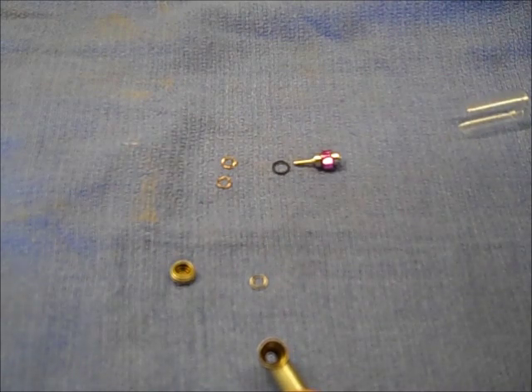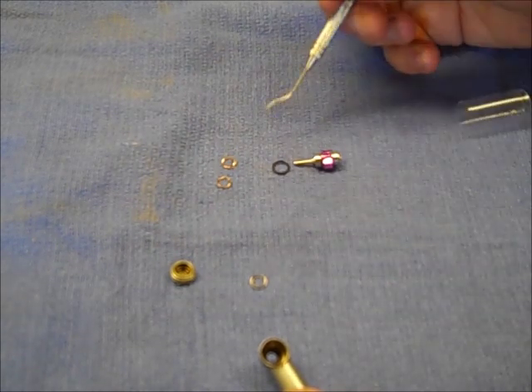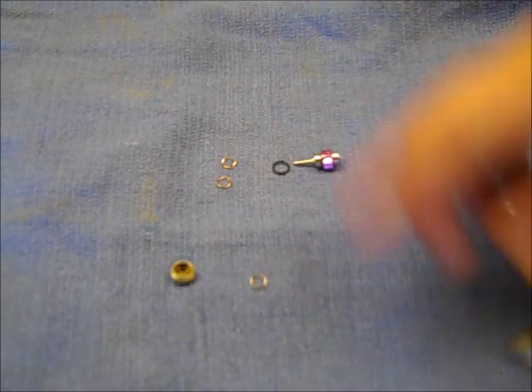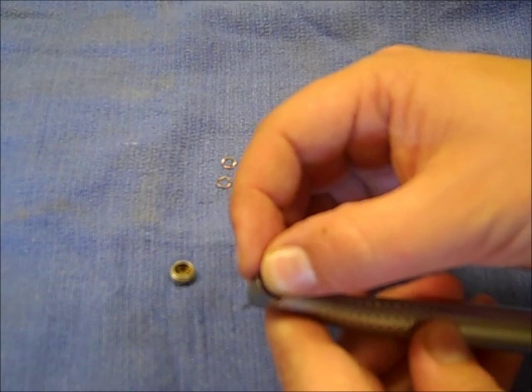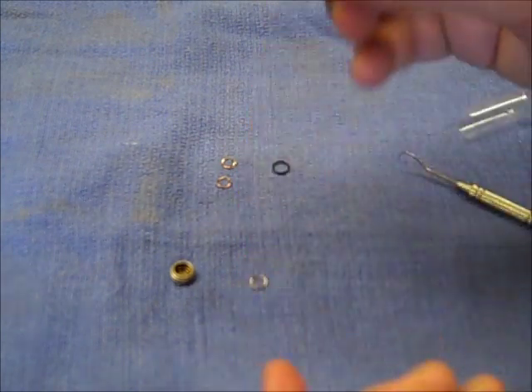On that Teflon washer, if it's a factory one it's going to have a little relief area — like a depression, a groove almost — and that goes up towards the turbine, so it would face the bearing on the turbine. Now that the O-ring is in, take the new turbine and put it into the head of the handpiece. It can use a little gentle rocking and it will seat in there all the way.